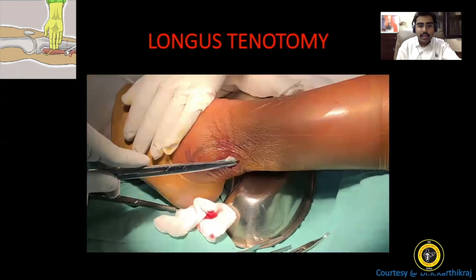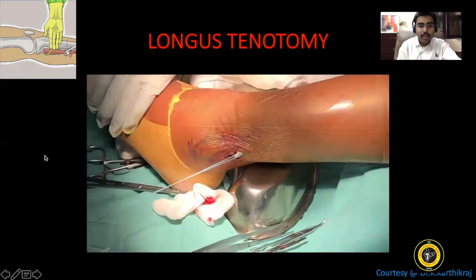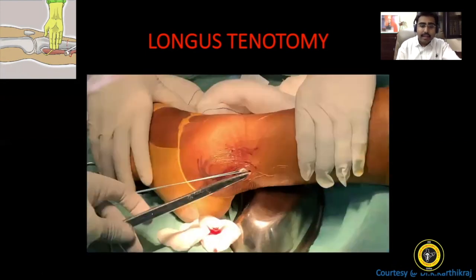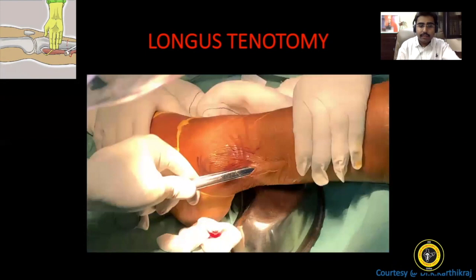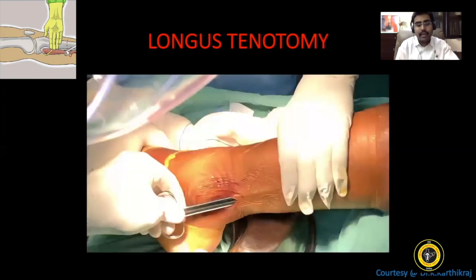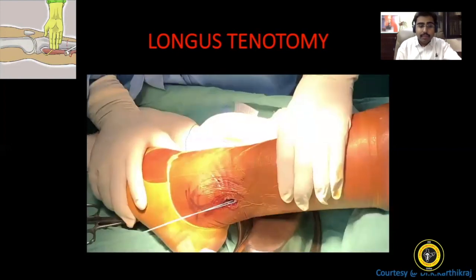Now you can see that nice and clean. Now the other trick that I use is utilizing a long curved scissors and running it across the skin and fascia above the longus. Now that helps me clear or blunt dissect before I put in a tendon stripper. So that prevents the chance of any premature amputation of the tendon.